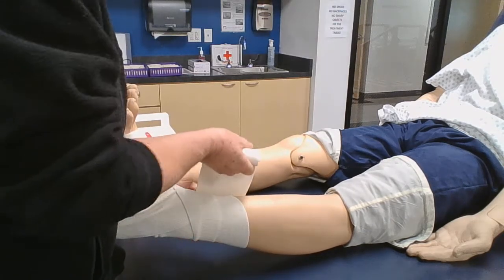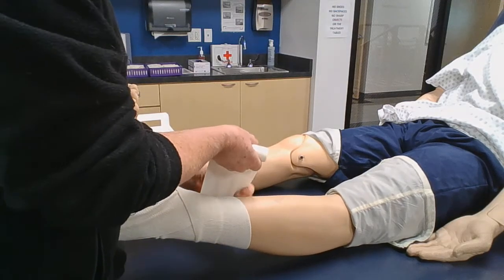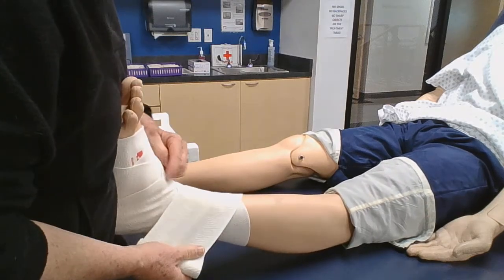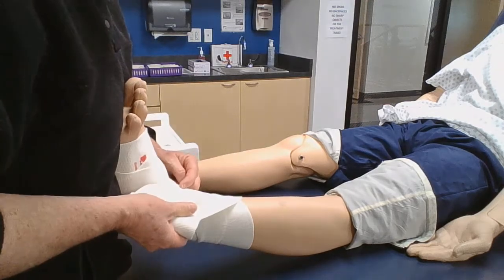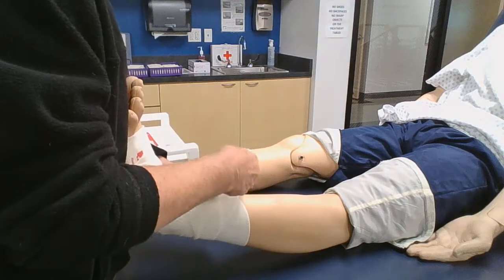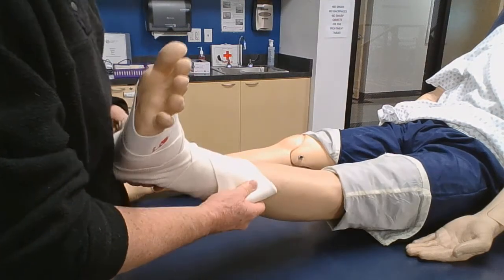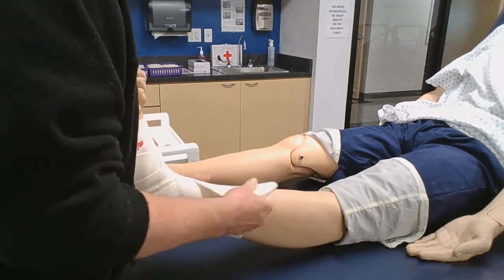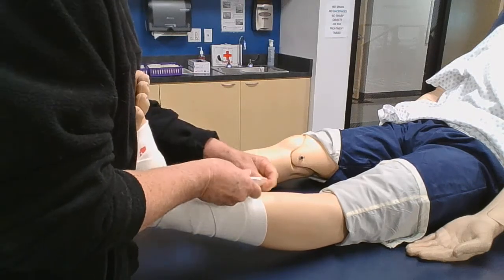Up. So what you want to be thinking about is up and down, okay? And laying it down exactly where you want to lay it down, okay? So if I've laid one here, I don't want to lay it over here. I don't want to lay it here. I want to lay it right here where it's going to go up, okay? And same here. If I'm starting my pattern here. And I can't see that too well. But when you guys are in lab, I'll be working on that with you. Okay, so I'm going up and around and down.